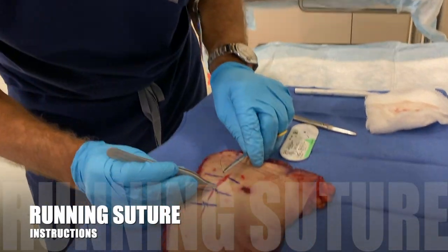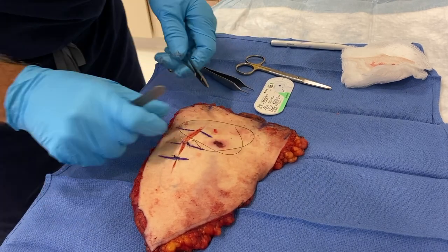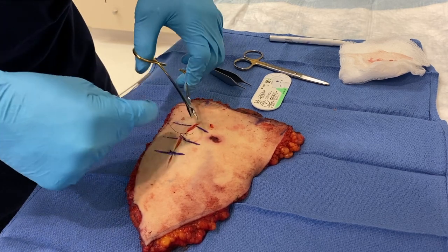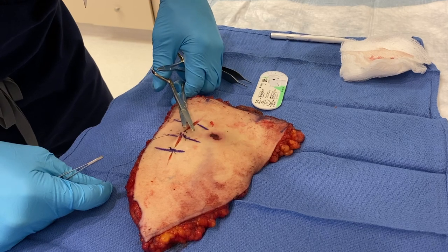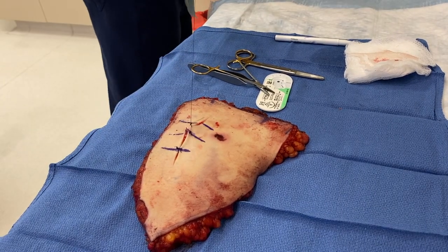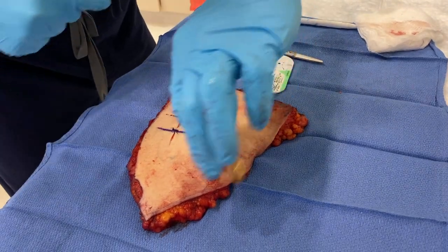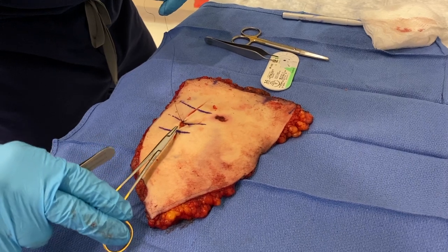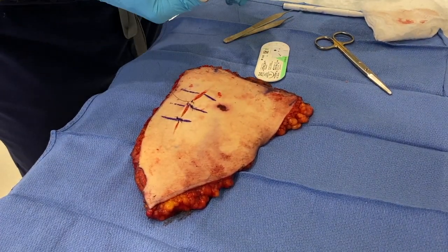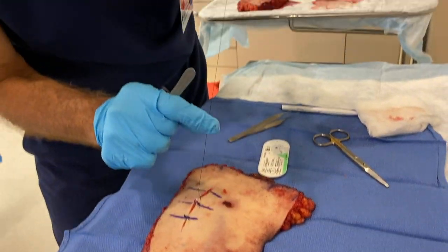Now let's practice a running suture. We can begin here with a simple stitch as our first stitch, then bring the skin edges together. Here's a little trick: we can actually use a hemostat on the end of this suture and use it to hold tension so that we have some counter-tension. We're not going to do that in this case, but it's a good little trick to have. So now I've cut the short end and I'm ready to go.